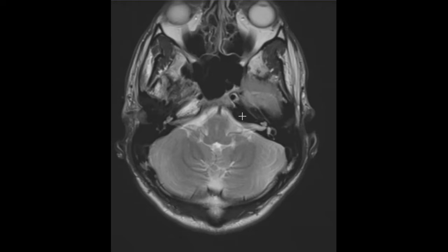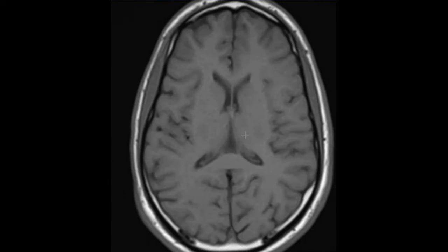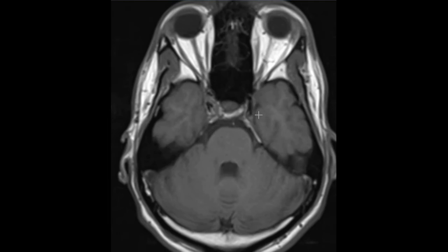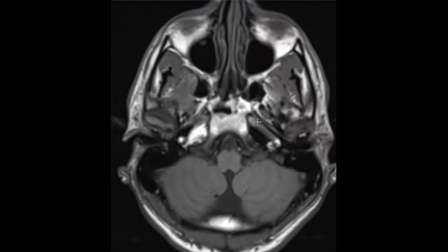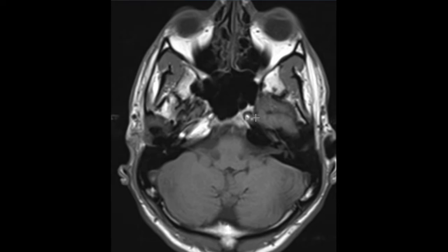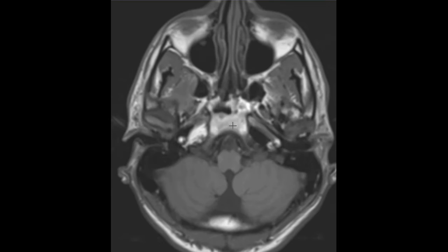This is a pneumatized petrous portion of the temporal bone — the mastoid portion is filled with air, and this petrous portion is also filled with air. Now we're going to put up this T1-weighted view and find the same area. Fat is bright, and now we can say with confidence that this is just fat.